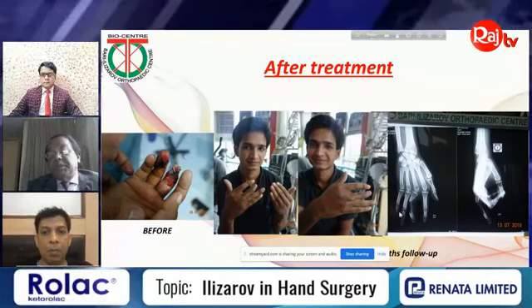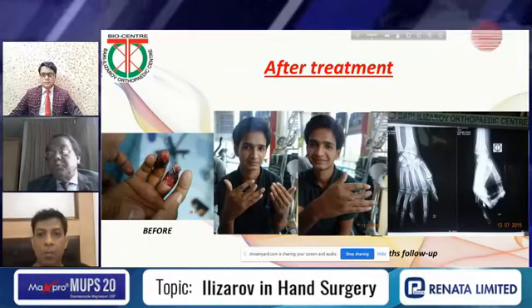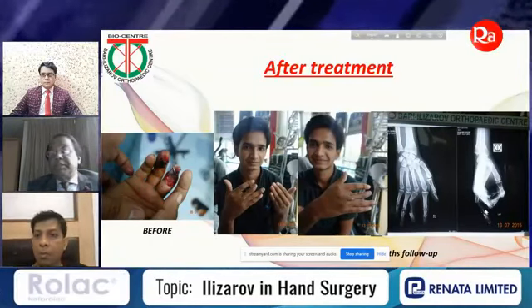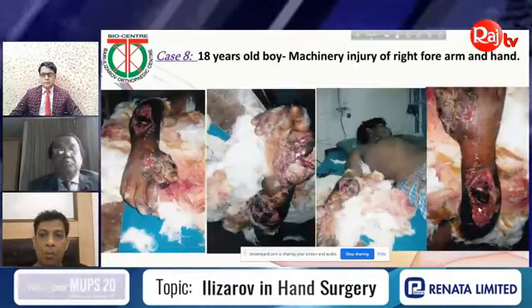finally, this is a little bit of angulation, but from here, the lateral side, you can see the good callus formation and the lengthening part of this part with good regenerated bone.